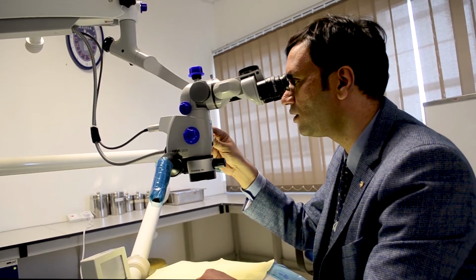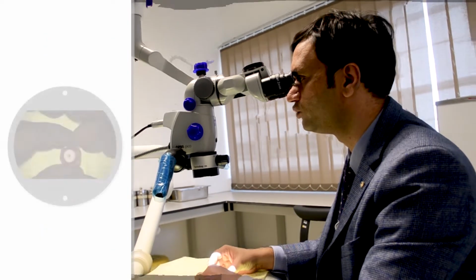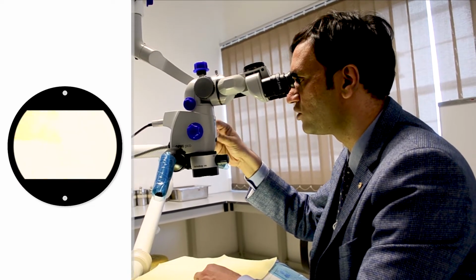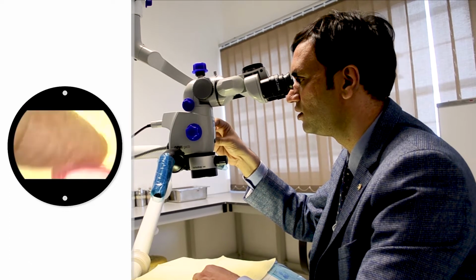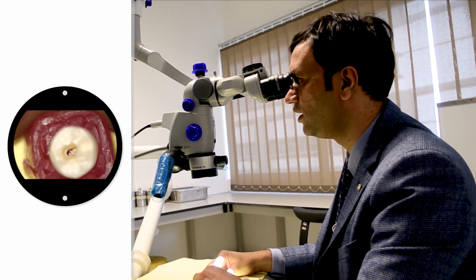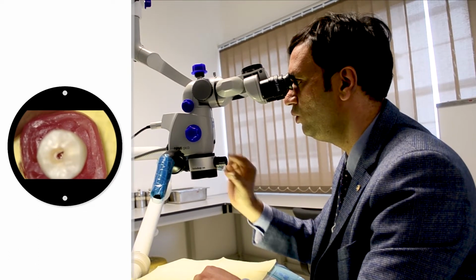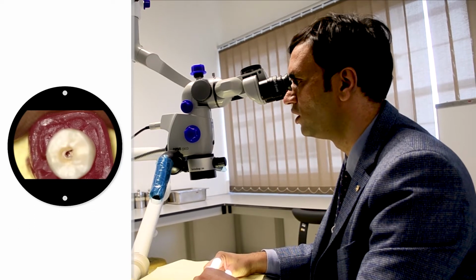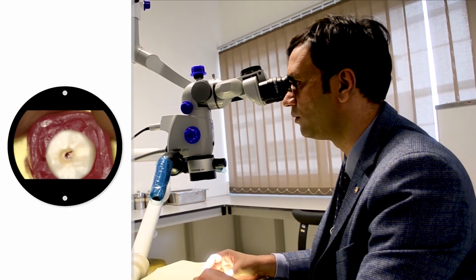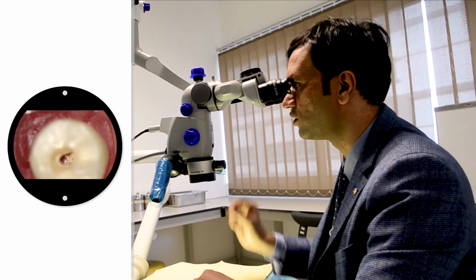You can start with maybe a lowest magnification of 0.4. So once you are comfortable with the view, you change the magnification factor to the highest, that is, you go to 2.5 magnification changer, and then again you slowly adjust the magnification. So once you got both of them in line, and you can see what you want to see, you have achieved your magnification.